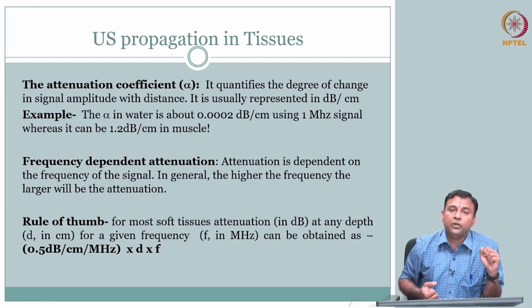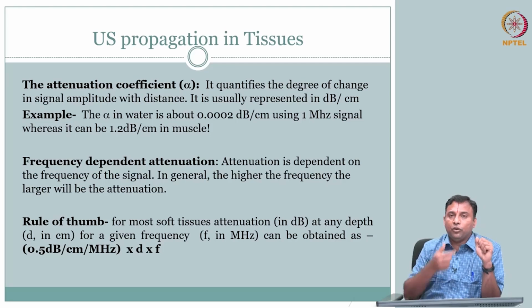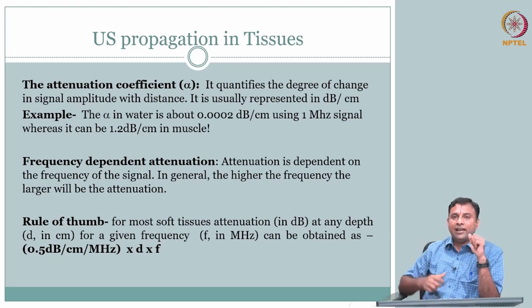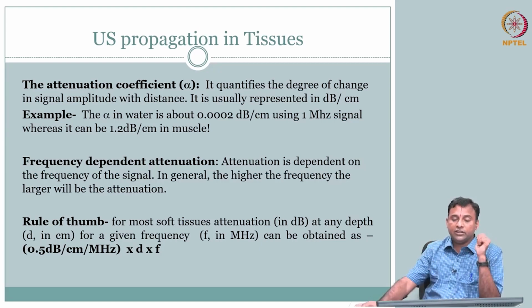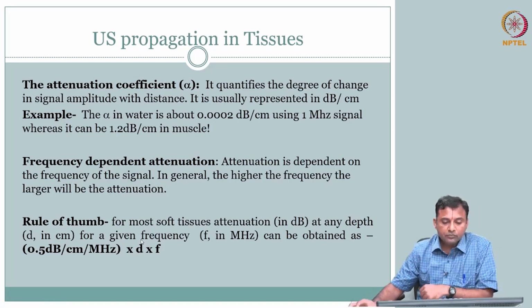That's why, we will do that in instrumentation as well, you will see that when you go for an abdomen scan, they will use a different transducer. When you go for some other, say, thyroid or heart echocardiography, they will use some other transducer. So the frequency they use is different, because the depth which they want to interrogate is different. Okay.